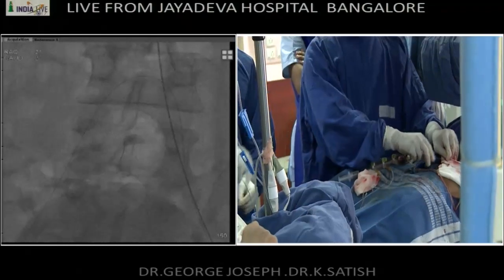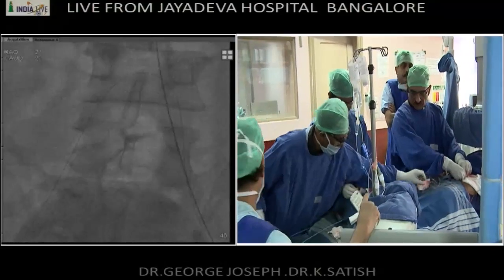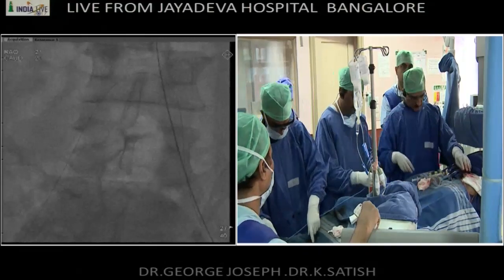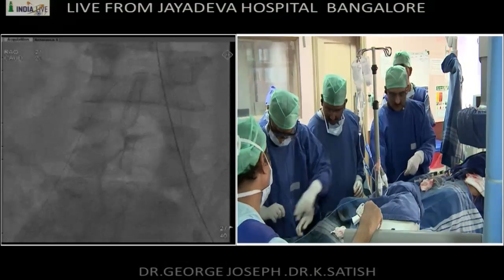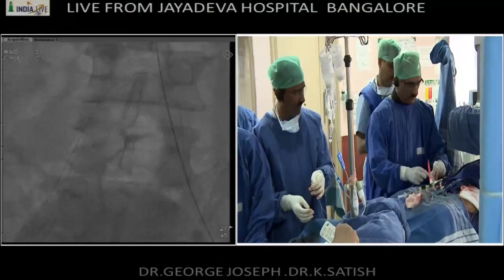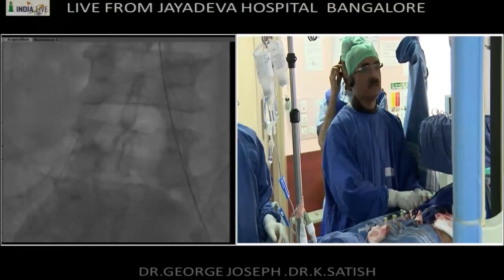Okay, I've got both the wires. You can take the catheter out. Right, so now 6F JR is coming up from the right side. Is that correct? Okay, we need another thermo from here. 035, 032, anything. We're just trying to pass it up there.